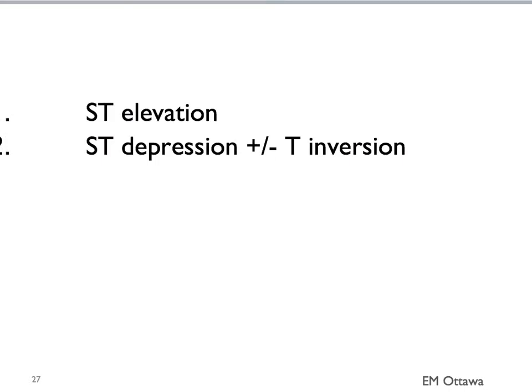In summary, we talked about how to approach the EKG of a patient suspicious of having ACS. Remember that we look for ST elevation, seeing whether they are territorial and reciprocal. If there is no ST elevation, we will look for ST depression and T-wave inversion. In the next section, we'll discuss how to use other diagnostic modalities in the patient with ACS.